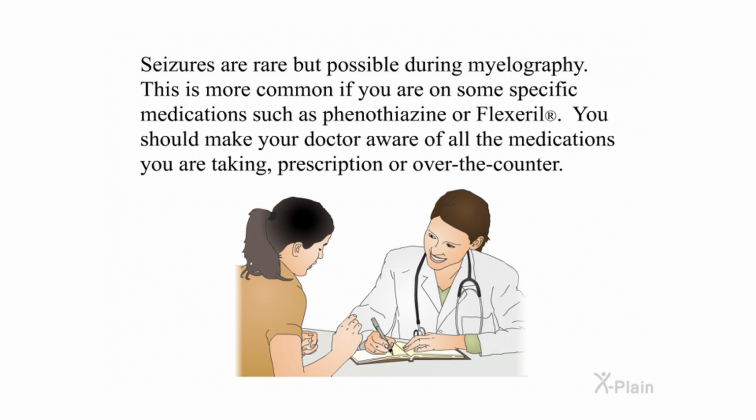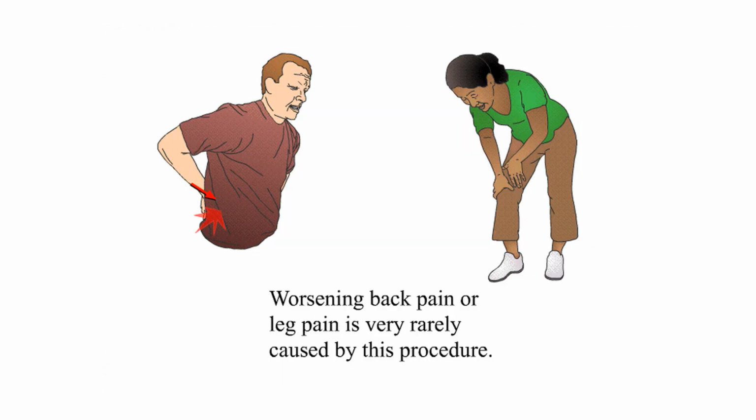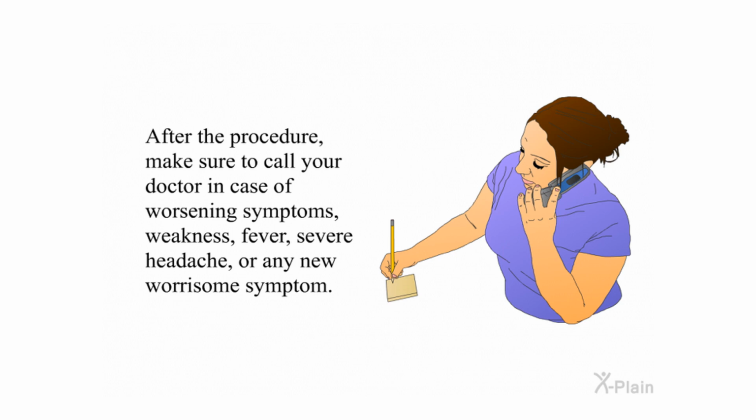Seizures are rare but possible during myelography. This is more common if you are on some specific medications such as phenothiazine or Flexeril. You should make your doctor aware of all the medications you are taking, prescription or over-the-counter. Worsening back pain or leg pain is very rarely caused by this procedure. After the procedure, make sure to call your doctor in case of worsening symptoms, weakness, fever, severe headache, or any new worrisome symptom.